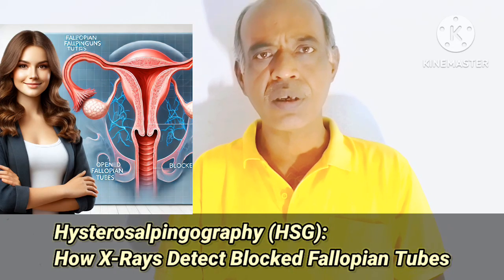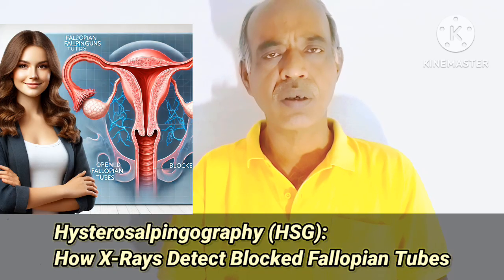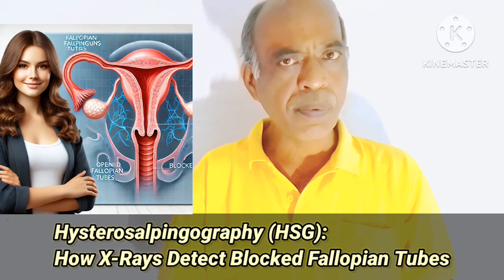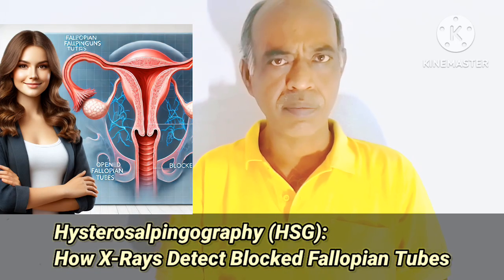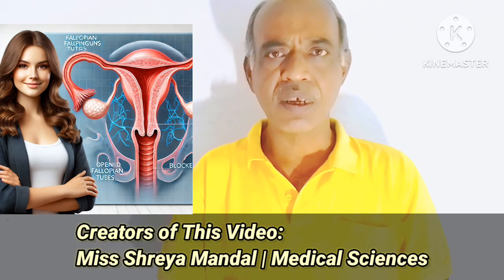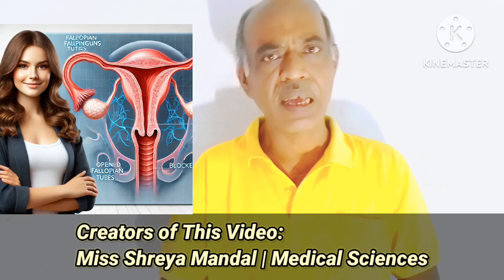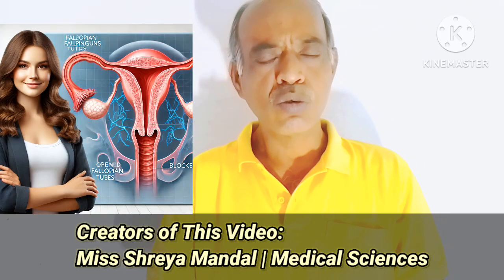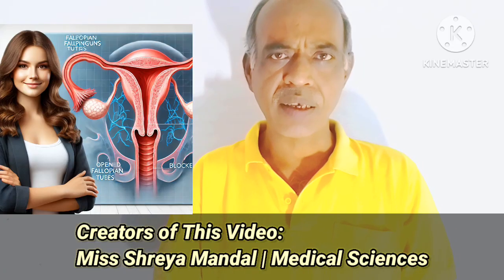So this is a medical condition, and how do doctors diagnose it? For that purpose, one technique is known as Hysterosalpingography, or in short HSG. This is basically a fluoroscopic X-ray technique. Real-time X-ray images are taken, and those are seen by the doctors to diagnose if there is any blockage inside the fallopian tubes. You know that two fallopian tubes are there, and if both are open, that's fine, there is no blockage.